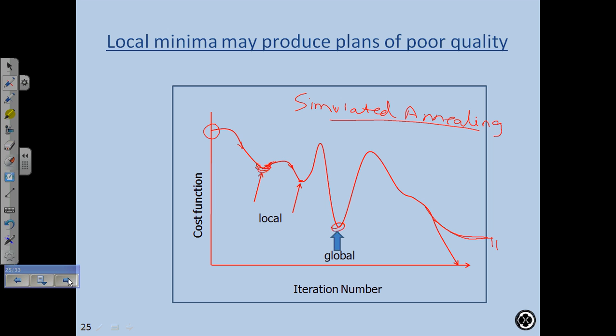I don't know if you can actually set it with Eclipse. With Eclipse, it's visual. You'll see the cost function start high, drop down, and level off. And with Eclipse, it's cool because you can change your constraints on the fly. So you can say, okay, now I want better coverage, so you can increase the coverage of the PTV, and you can see your cost function shoot up again, and then it starts coming down again. So that interactive ability doesn't exist in Exio. It does, but it's not as sophisticated as it is in Eclipse.